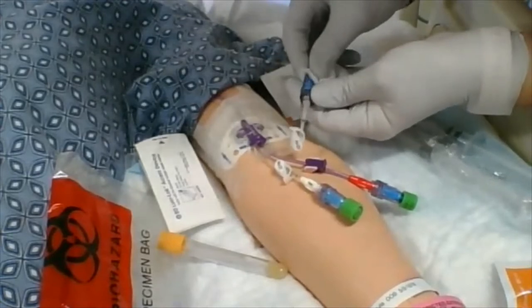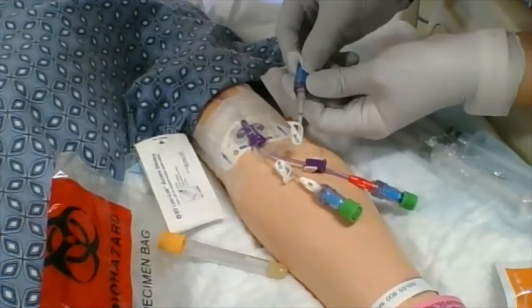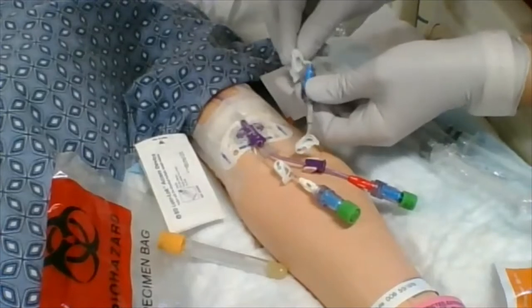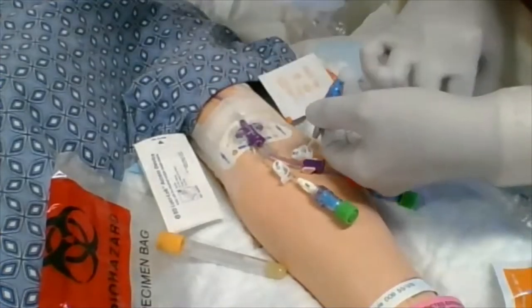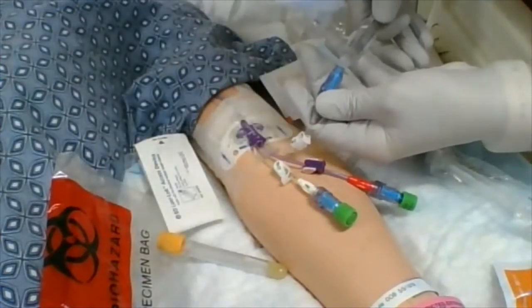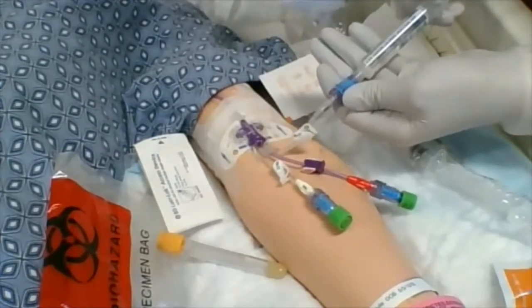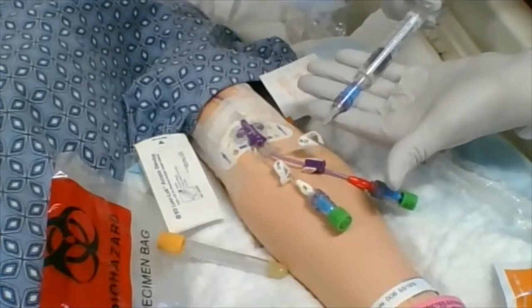I'm going to draw a waste tube via the 10 ml syringe. You could use an extra tube — just make sure you label it as waste when you begin withdrawing blood specimens. In my situation I'm using a 10 ml syringe. Here's my saline flush — tip is still clean from my alcohol. I'll put that on, unclamp, and give this some flush. I don't feel any resistance at all.